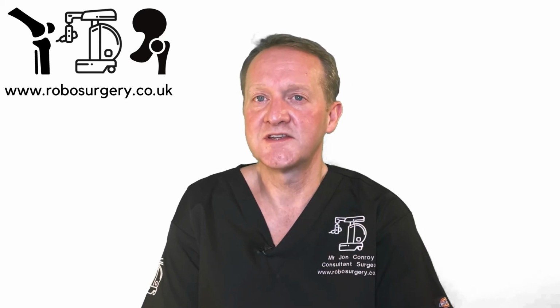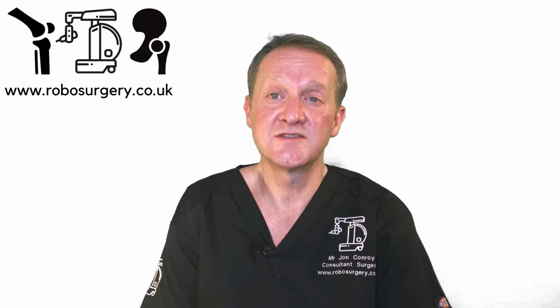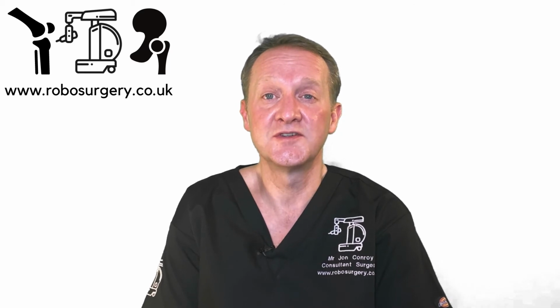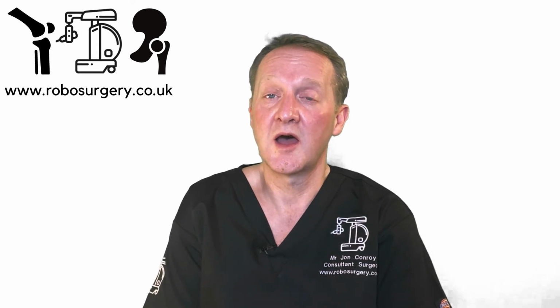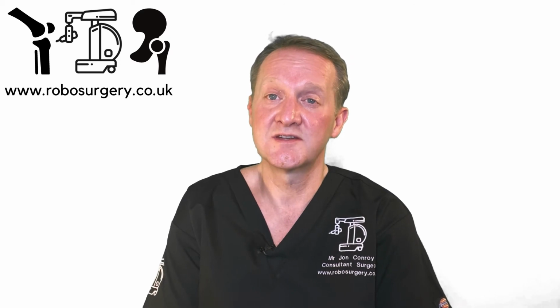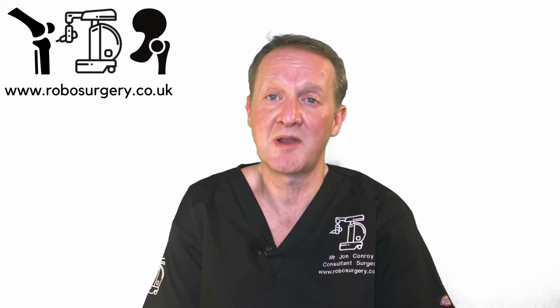Many patients after knee replacement surgery are dissatisfied with the outcome, and the reasons for this are multifactorial. But some of the reasons include oversizing of the implants, malalignment of the implants, or a problem with soft tissue balancing. Now, the Mako system allows us to predict the size of the implant through 3D CT planning.